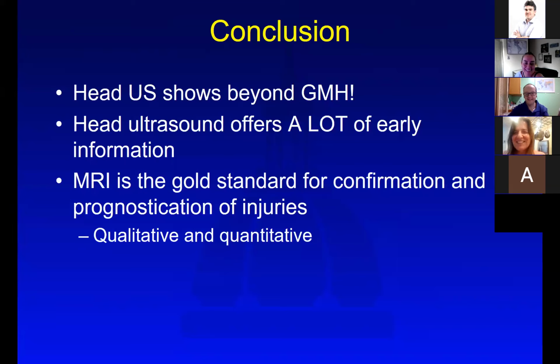I love this. My question is actually, now I'm working in Florida, and in our hospital, when they have a suspected fracture of the skull, they do CT, so I cannot recommend ultrasound because I cannot see the fracture. And MR, I don't have that much experience with what they do, AYLIN.